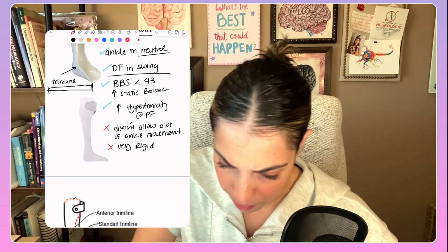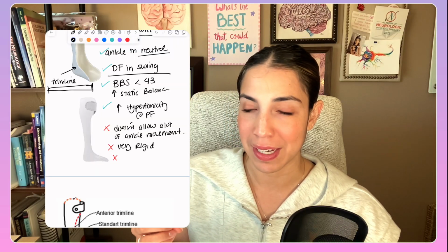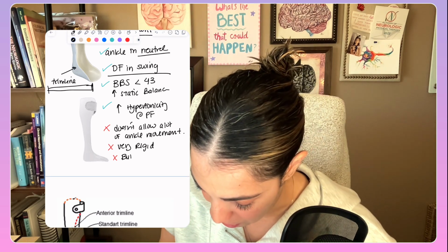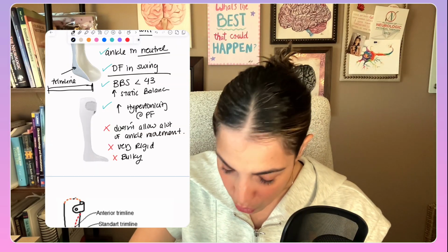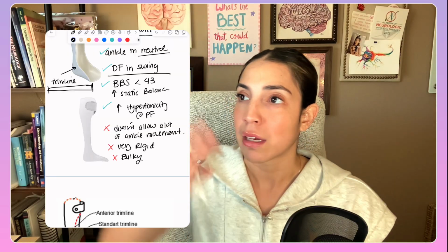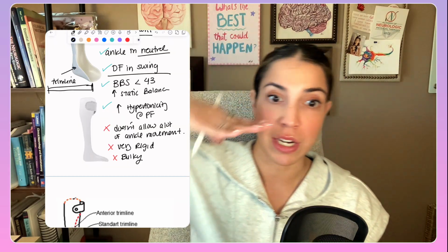And it's going to be very heavy sometimes. Not as heavy as the articulated dorsiflexion assist and all that, but it is bulky, is what I'm trying to say. It's bulky. If you are trying to improve pre-swing, like plantar flexion, the propulsion, right?